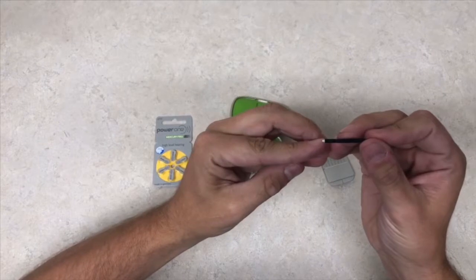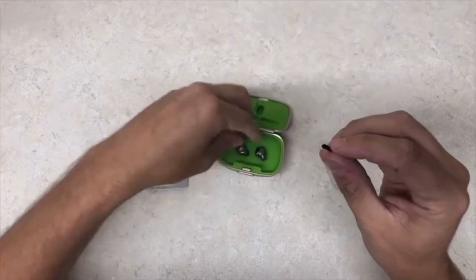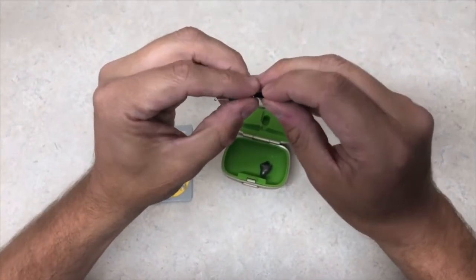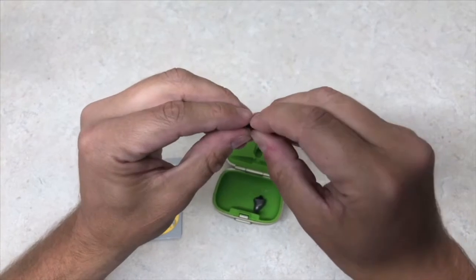You have a new wax trap here, and you have the tool to remove the wax trap on this end. Use the removal tool to take the old wax trap out, spin it around, and put the new wax trap in.